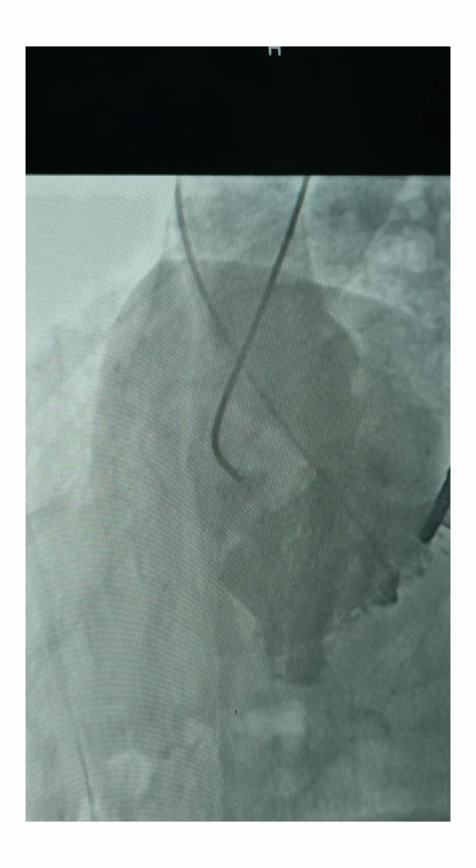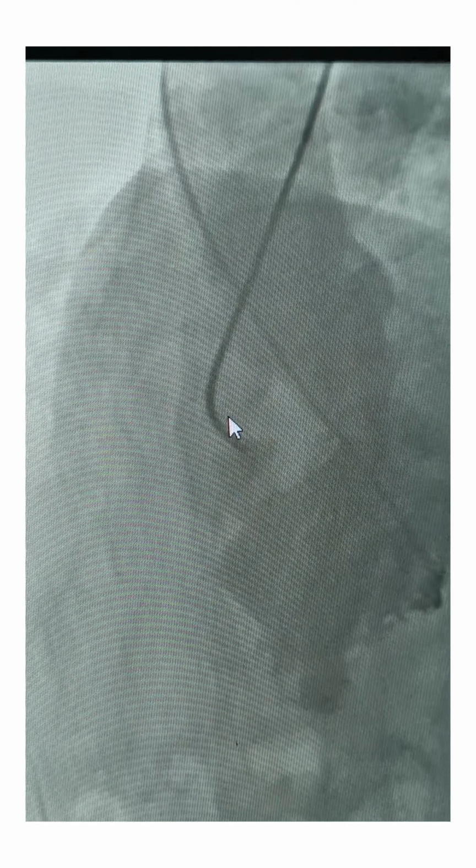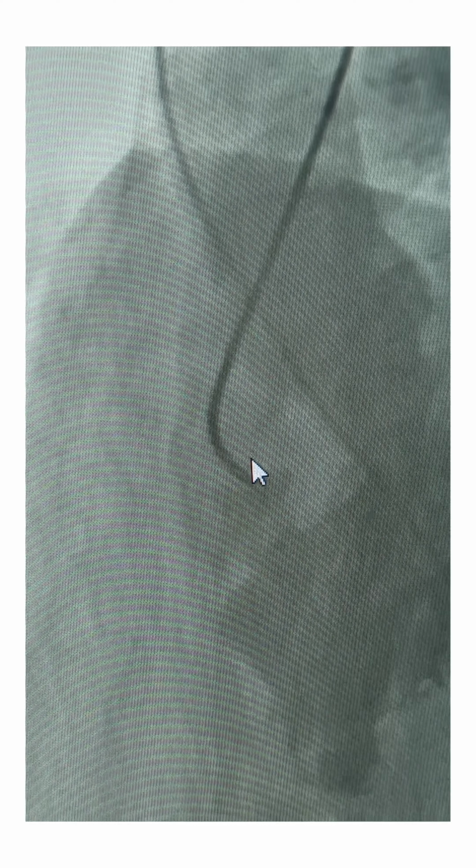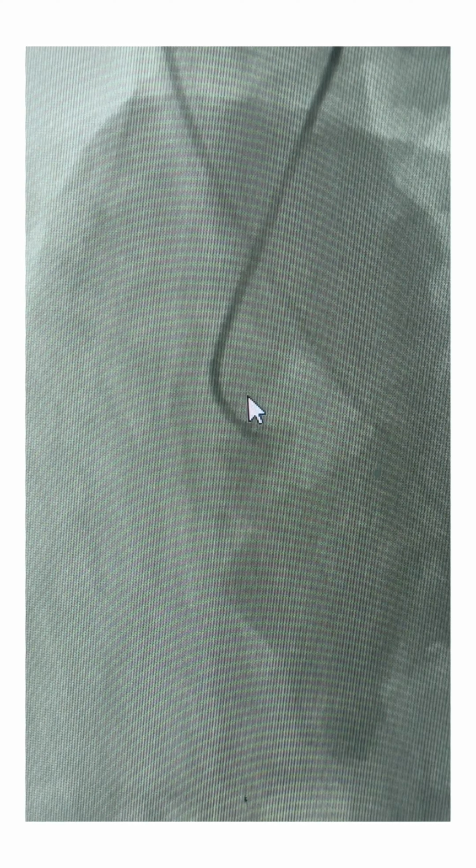So something about the device which I had taken. This is a Life Tech muscular device. It will have 2 discs. The waist diameter of the device is 8 mm. The length of the device is 7 mm and the retention disc will be 14 mm each side. If you measure the interventricular thickness of this person, it was coming 10 to 12. So if you try to deploy a 7 mm long device into a 10 mm septum, and at the same time you want to make sure that the device does not embolize, you have to pull the device as much as possible into the RV end of the VSD.